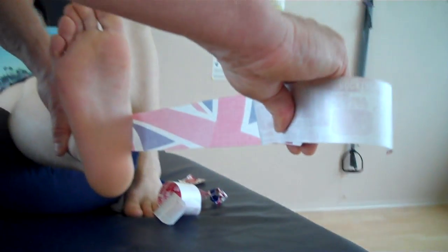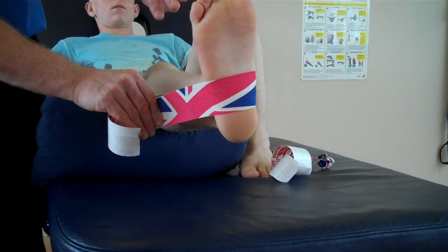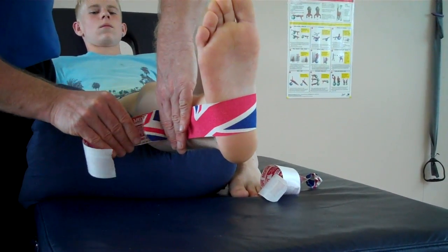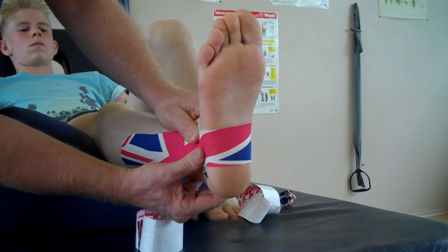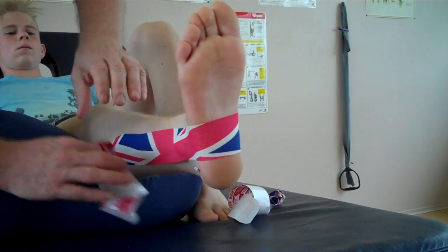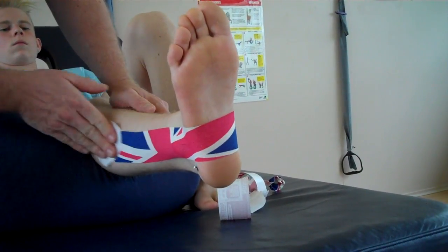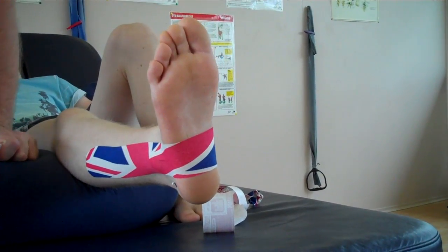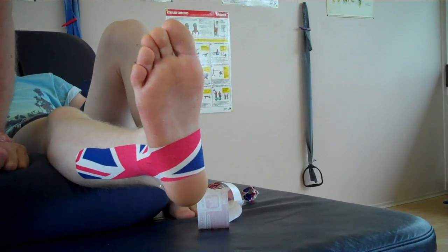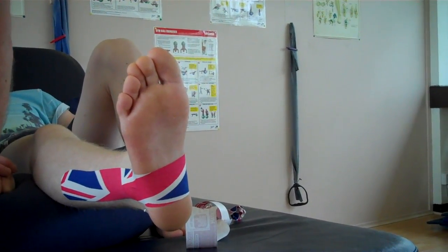This time instead of 100%, ease it off to about 75% stretch. Keep your foot there. So we still have some stabilisation, but not as much. Lock that down — no stretch at the end. Feed that end out and mould it down, covering the ATFL ligament in particular. Using the back of the tape or your hands, just heat activate. And that's 75%. We can try that for sport, and from there we can go to 50% and to 25%. That would be a simple J-strap using kinesiology tape.